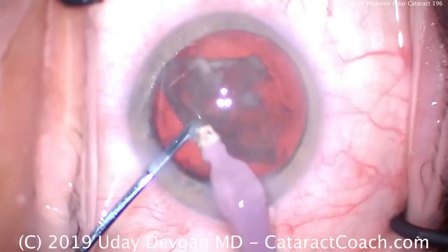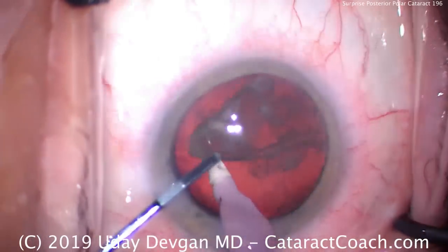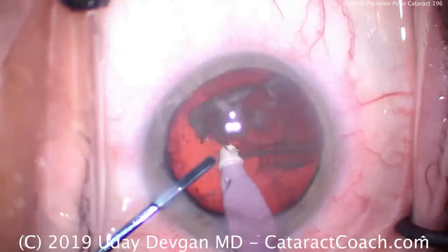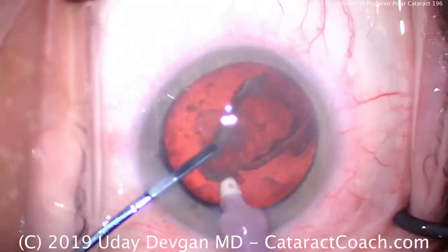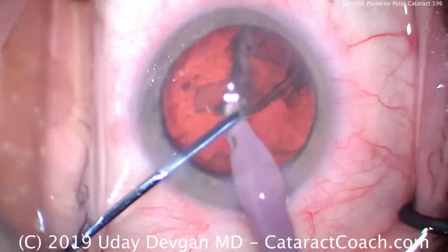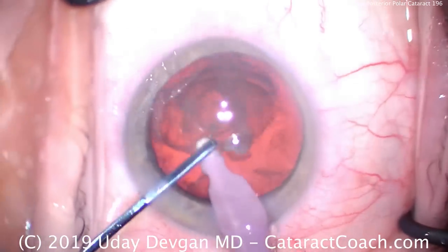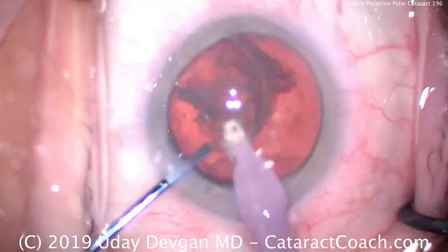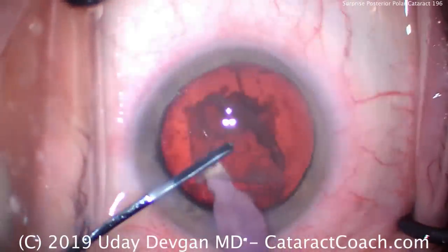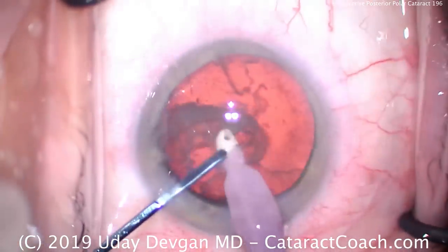Let's fast forward. We've had many posterior polar cataract cases here on cataractcoach.com — you should definitely review those; we've had three or four already. And in this one, you know from the posterior polar cataracts that we have to be very careful not to touch the posterior capsule. Here we're taking out the remaining epinuclear shell with a little bit of cortex left. The key is you absolutely cannot touch the posterior capsule.